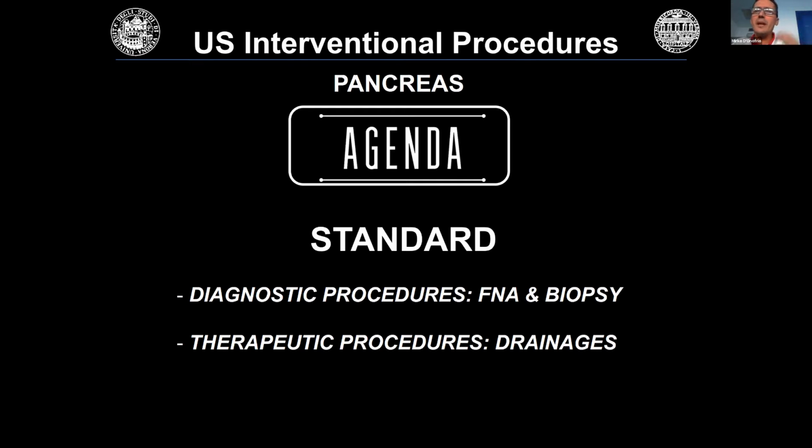We can perform 10 procedures with the pathologist together with us, so as to have the final diagnosis for 10 patients in one morning. And really, normally in everyday clinical practice, we don't feel the need to use fusion imaging if the lesion is well visible and well reachable by using ultrasound with a percutaneous approach.